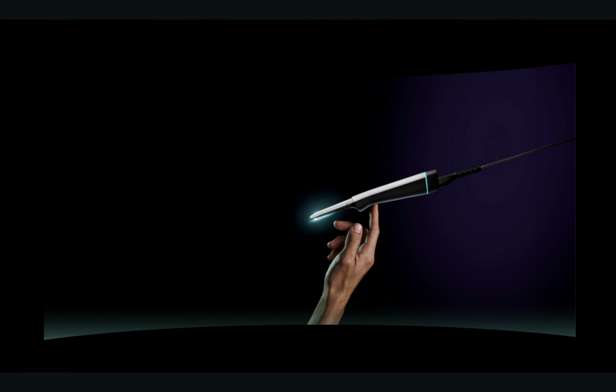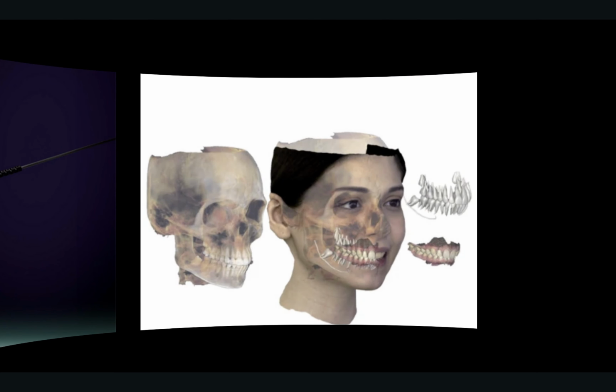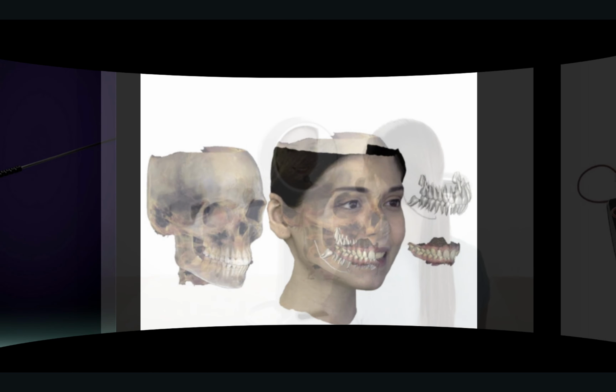And that brings us to now and the next steps. I always say to patients, we're living in the future, but the future is now. And because we are such a driven profession that we want to push these boundaries and develop and change technologies, the future is always now. We now have the ability to have these complex stacked data builds that show us the convergence of tooth, bone, gum, facial tissues, nerves, all of the aspects that we can gather together.